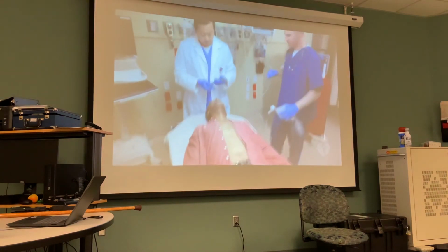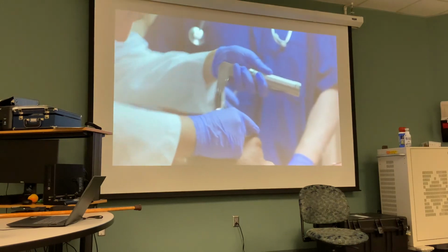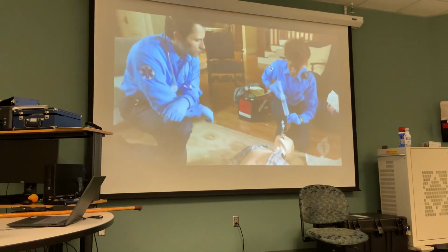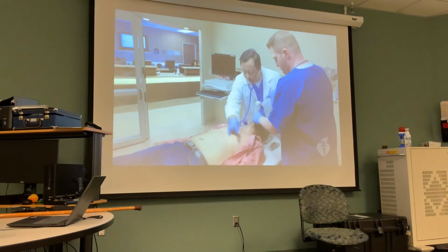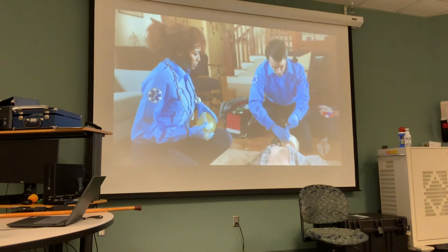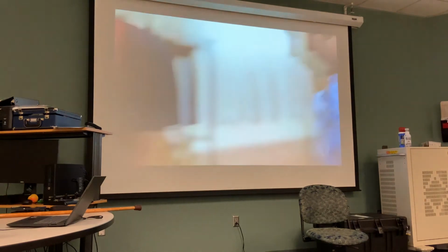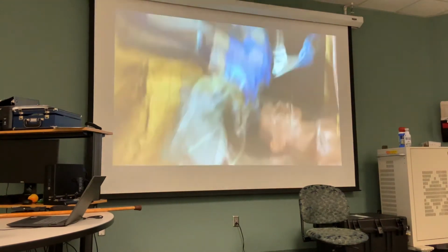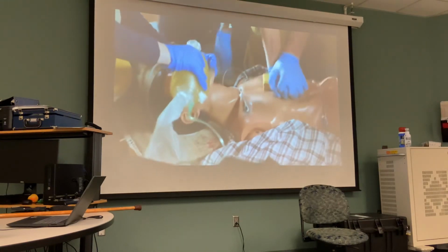Healthcare providers who use advanced airways within their scope of practice must maintain their skills by using them frequently. The American Heart Association recommends that you become familiar with a variety of devices, but master one primary method of advanced airway control. If you are unable to establish an advanced airway, continue ventilation with a bag mask device.